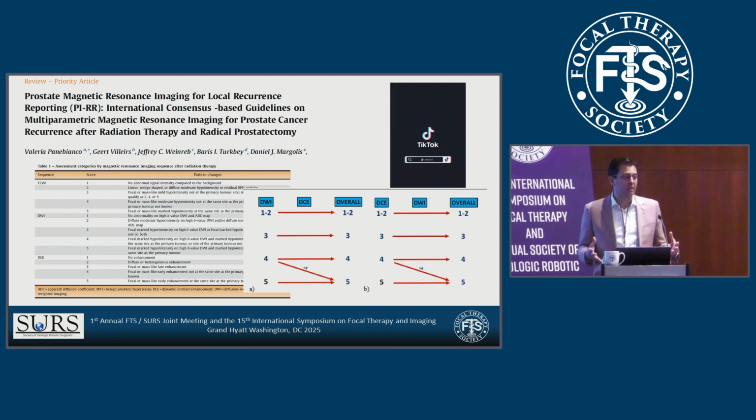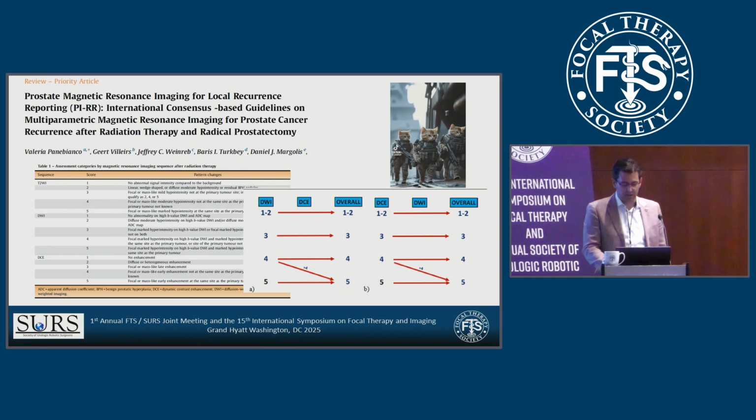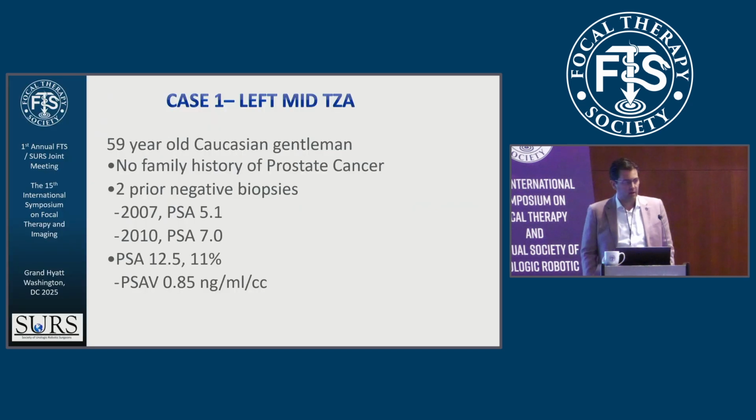But this is something that you guys should be aware of, and your radiologist should incorporate this into their workflow, because PI-RADS is not a meaningful risk stratification for it. For the remainder of my talk, I'm going to go over 5 cases. Hopefully I'll finish all of them. This is basically to give you an example of a left mid TZA lesion.